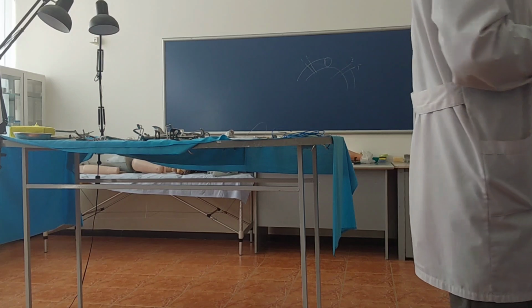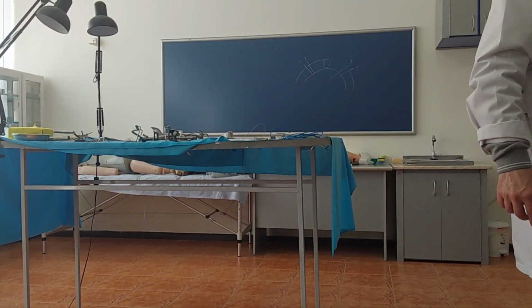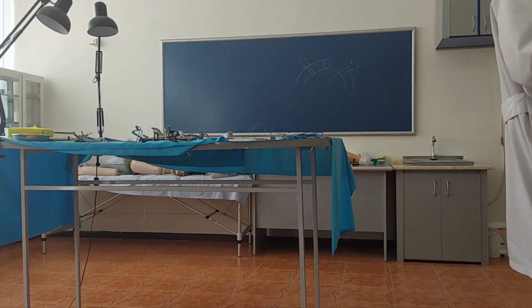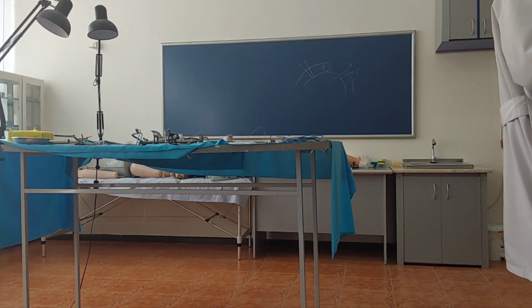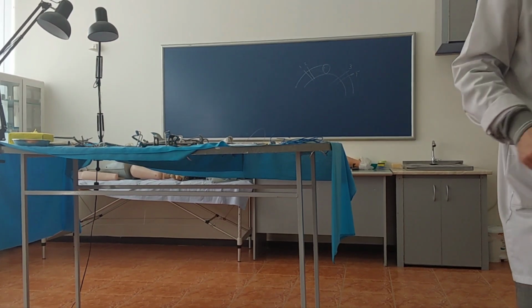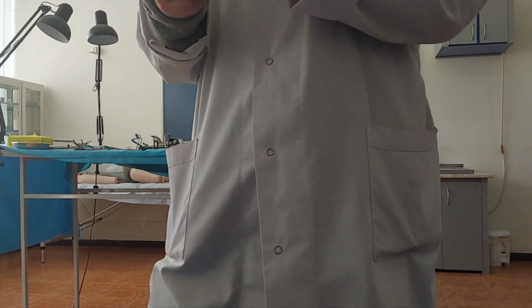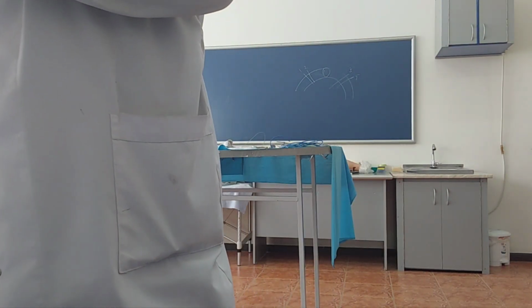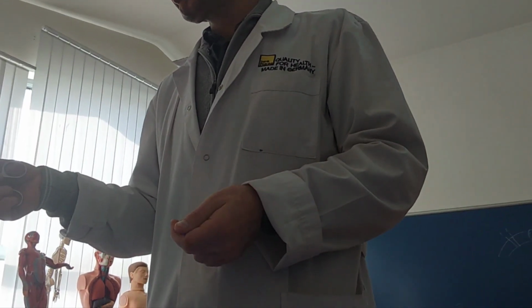Second, you can check now that I fix my needle by middle part of my needle holder, not by tip and not by base. For fixation, I prefer to use middle part, something like this. Then you can see that I divided my needle into two unequal parts. 1/3 it is eye, 2/3 it is sharp part.